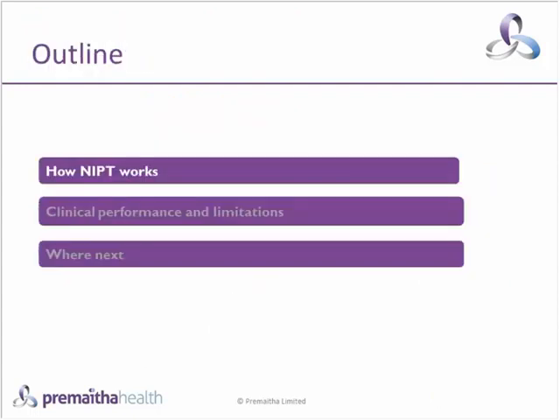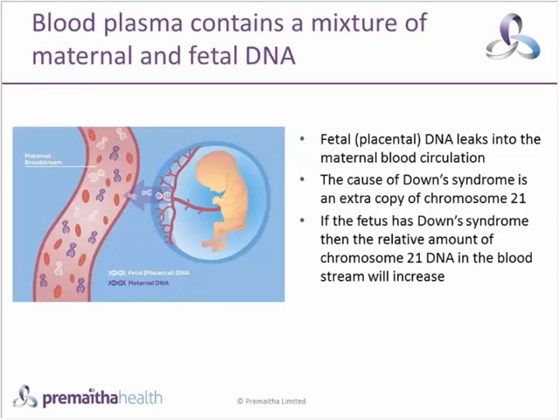So first of all, I'm going to talk a little bit about how NIPT works. I'm sure some of you know some of this already, but there's a couple of interesting points perhaps that might be of interest to you. So the first thing is we often talk about fetal DNA in the maternal circulation. That's the first lie. It's not fetal DNA at all, really. The DNA that we find associated with the fetus in the maternal circulation comes from the placenta.